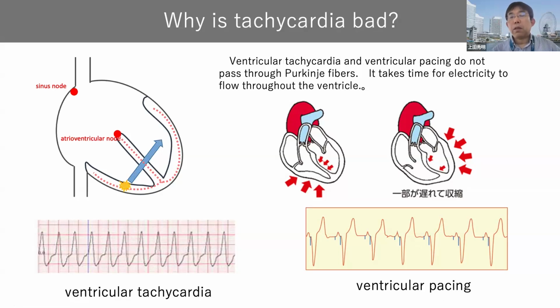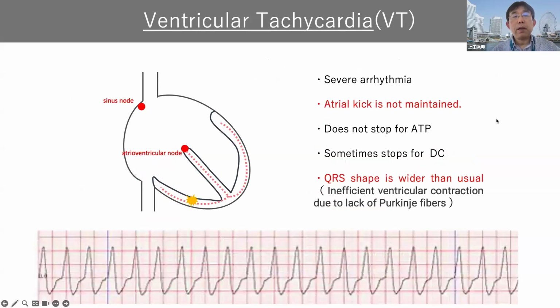If not, we will think about placing another pacing site and pacing simultaneously to make the contraction timing the same. And that should be very important for us.